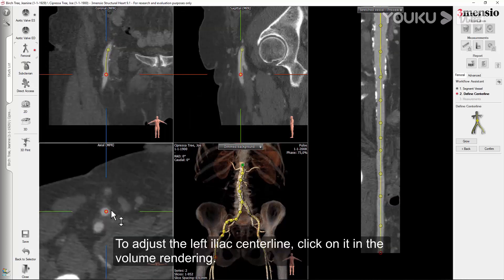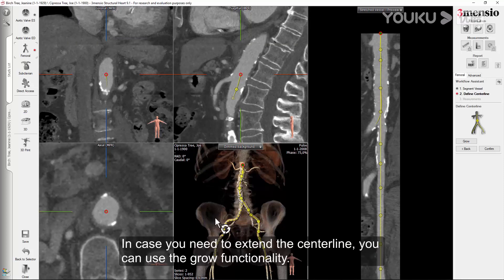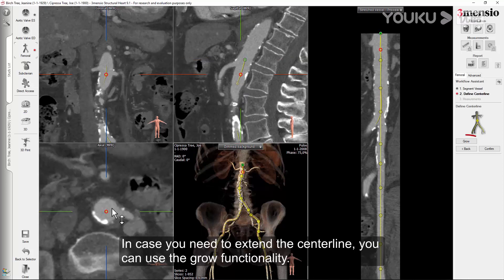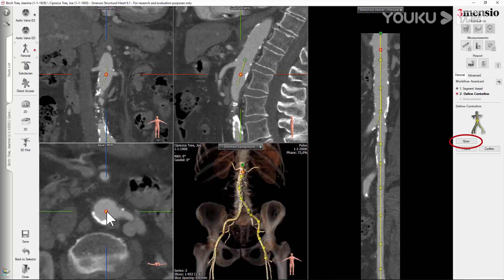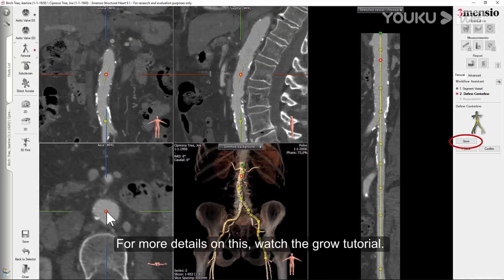To adjust the left iliac centerline, click on it in the volume rendering. In case you need to extend the centerline, you can use the grow functionality. For more details on this, watch the grow tutorial.